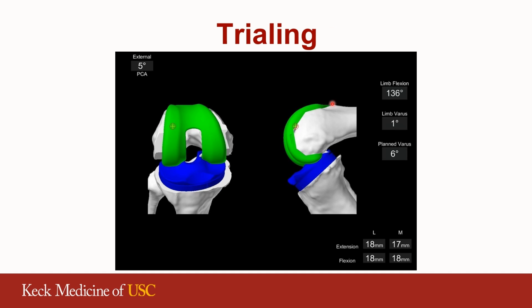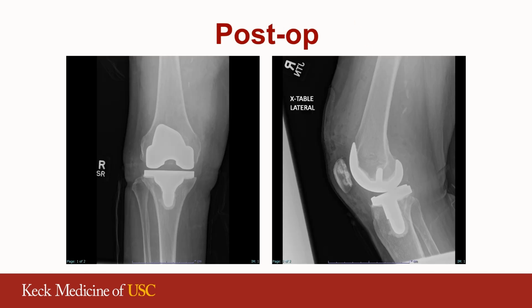We started out at 120 degrees. With these adjustments, now we're up to 136 degrees end range of motion. And then we'll confirm our image. So this is our post-operative image.